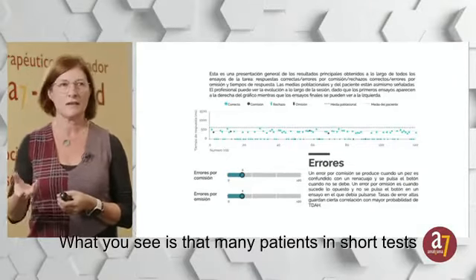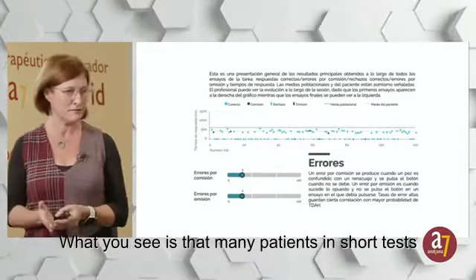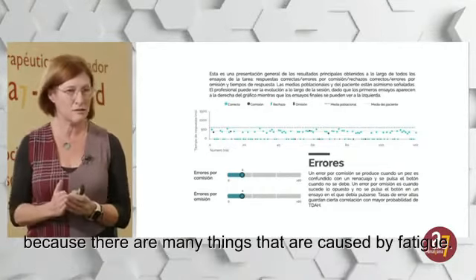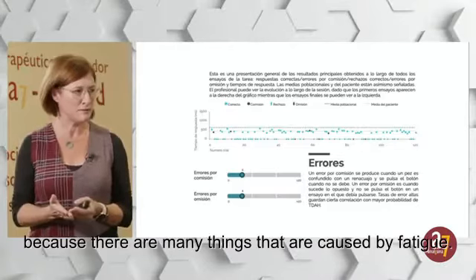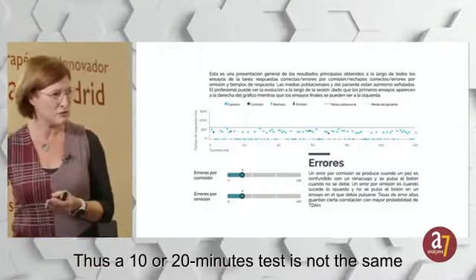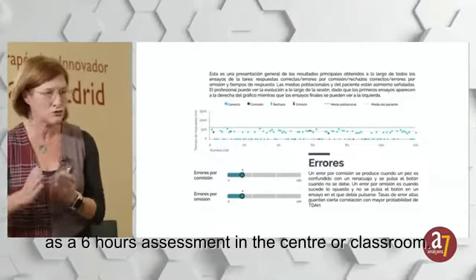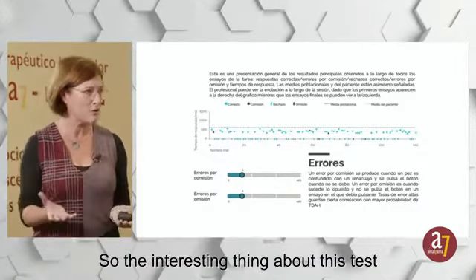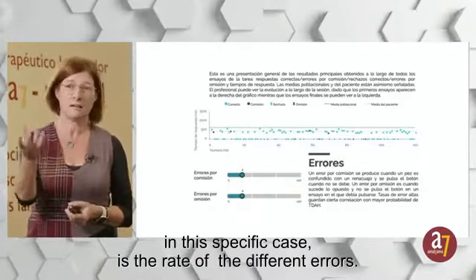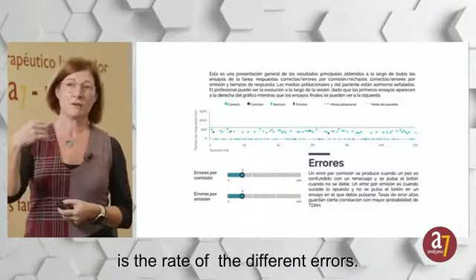What you see is that many patients in short tests are motivated to perform the test well, because there are many things that are caused by fatigue. Thus, a 10 or 20 minutes test is not the same as a 6 hours assessment in the center or classroom. So the interesting thing about this test, in this specific case, is the rate of the different errors.